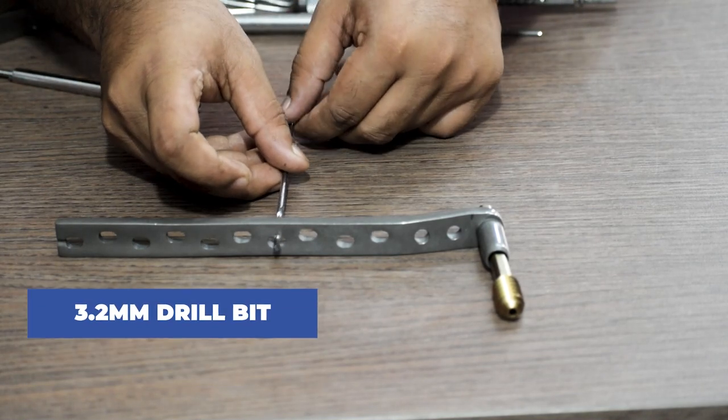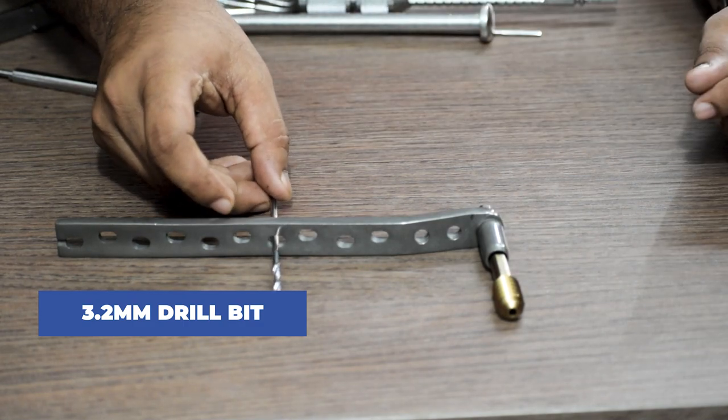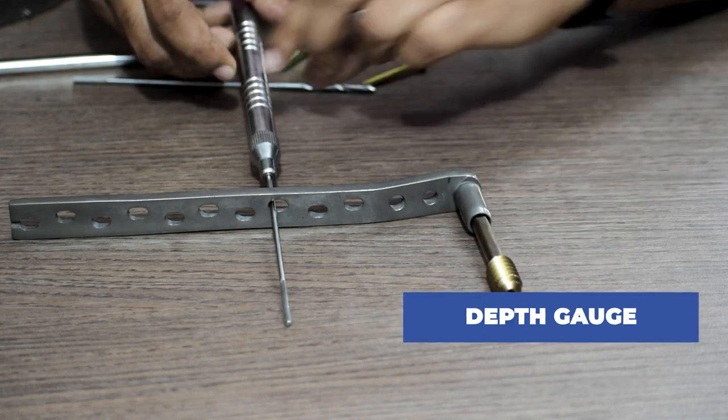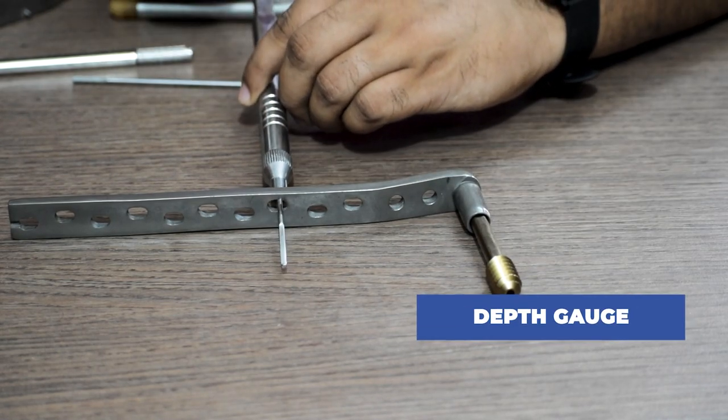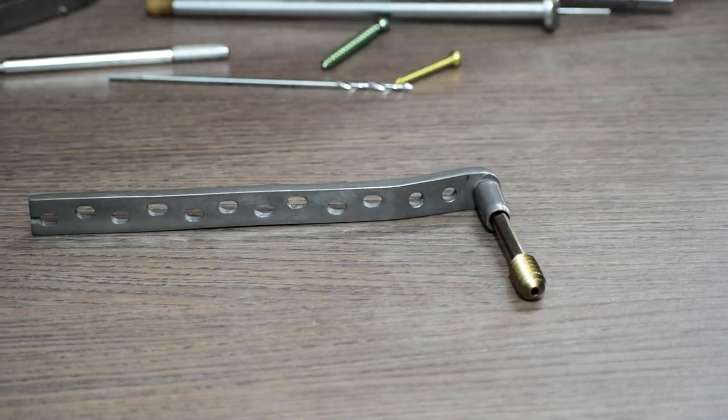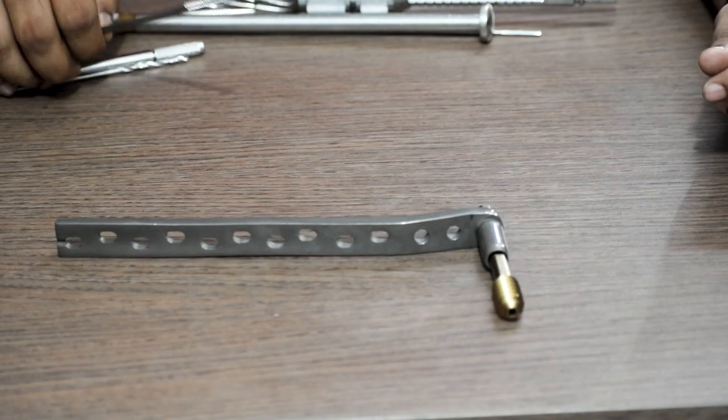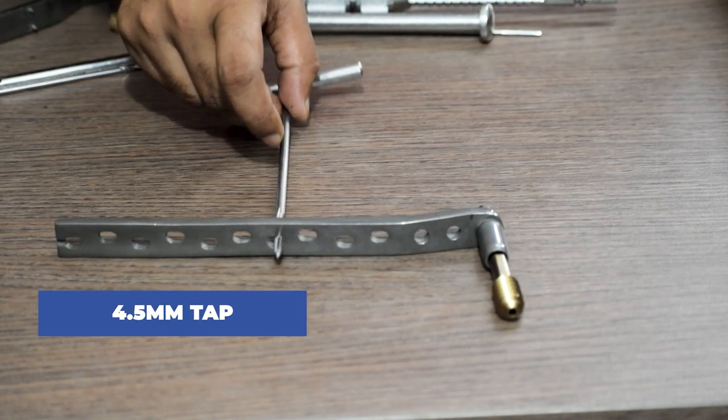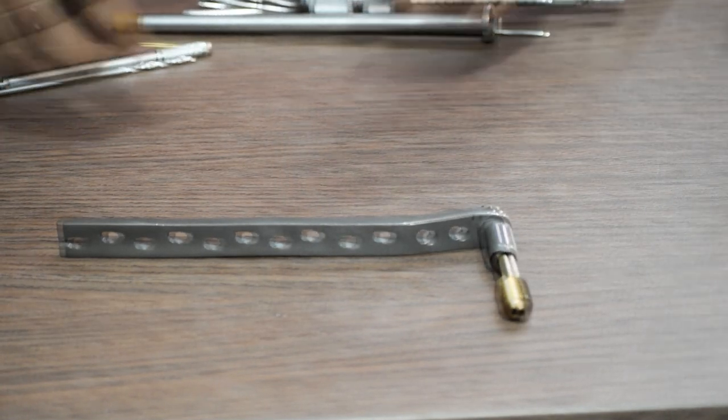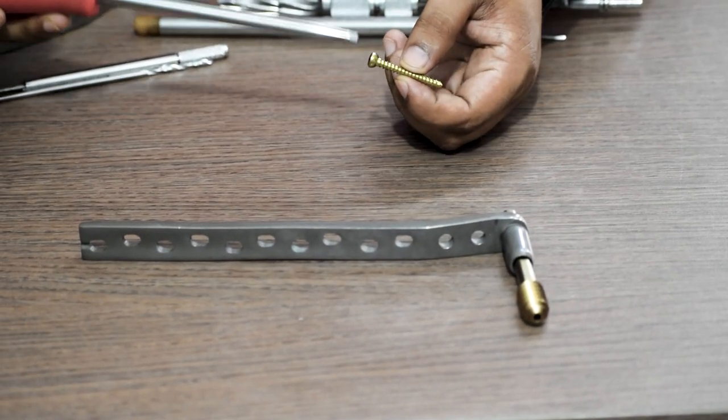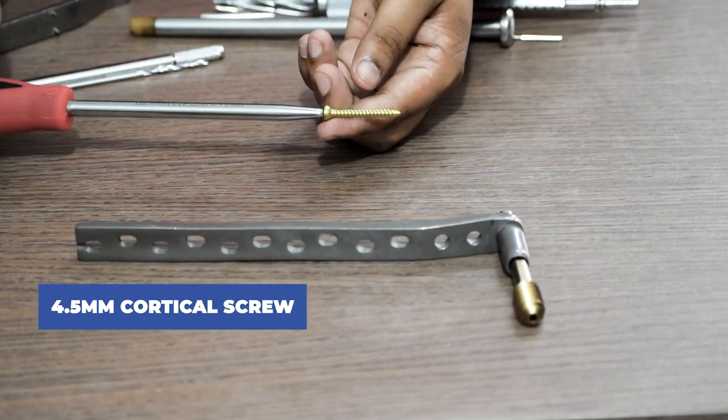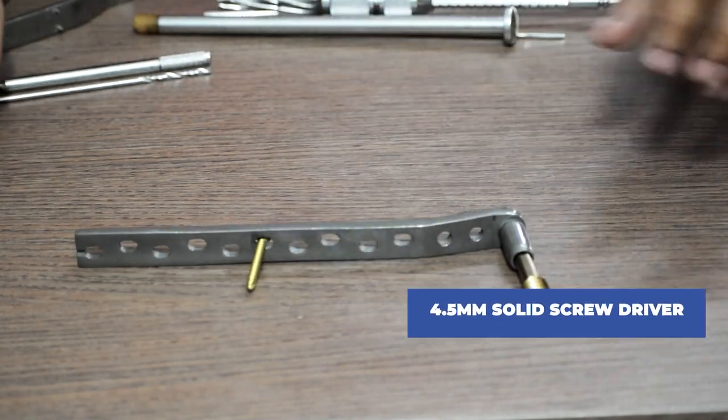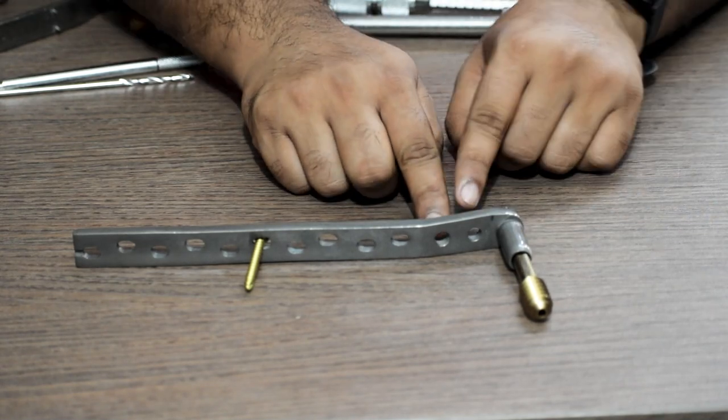Thereafter we use a 3.2 mm drill bit. Then we take the measurement with the help of the depth gauge. Then we use the 4.5 mm tap to tap through the hole. Then we take a 4.5 mm cortical screw of the measured length and with the help of a 4.5 mm solid screwdriver we fix the screw in the shaft region of the DCS plate. Now let us understand about these two holes.